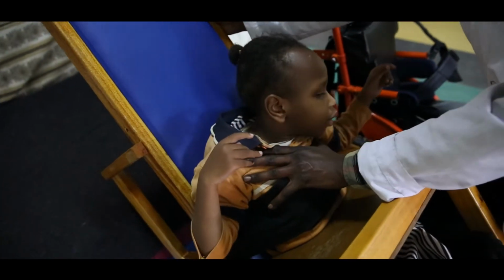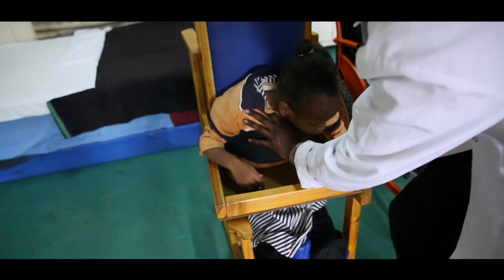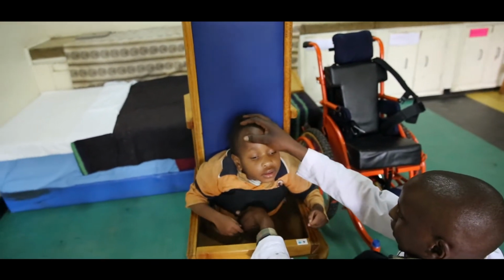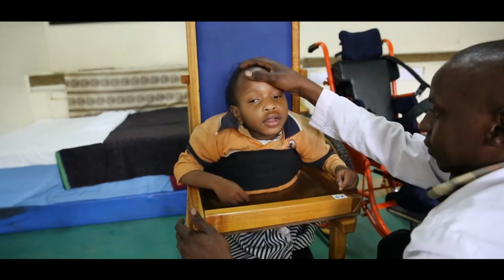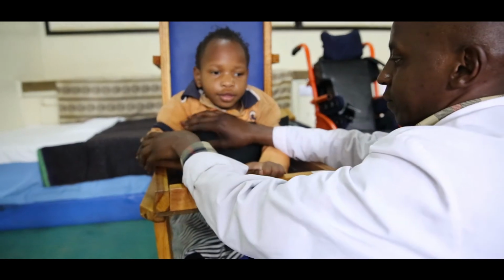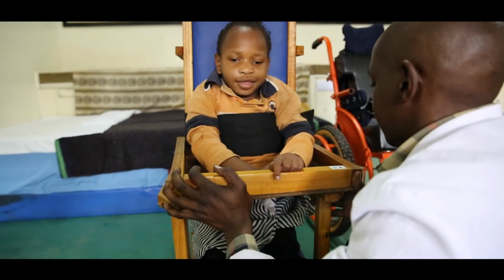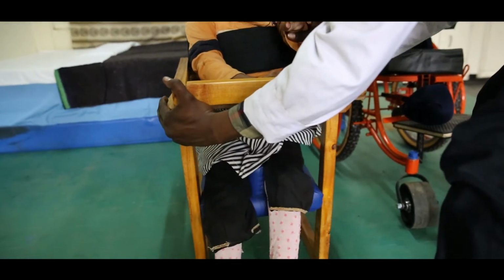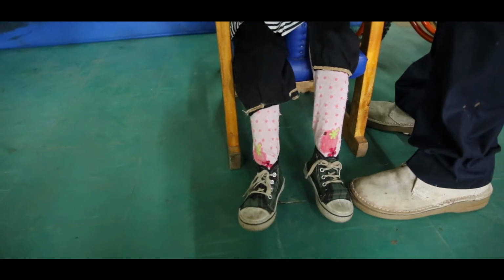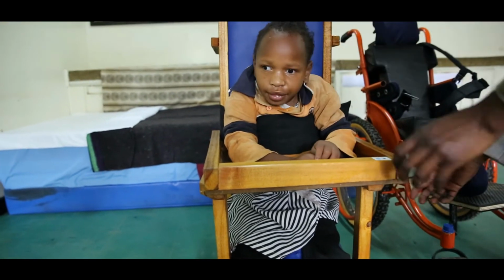Bring back the sitting aid into an upright position. Check the child again to ensure that his or her head, neck, back, and feet are appropriately placed. The child needs to sit for about 30 minutes at 4-hour intervals throughout the day for consistency.